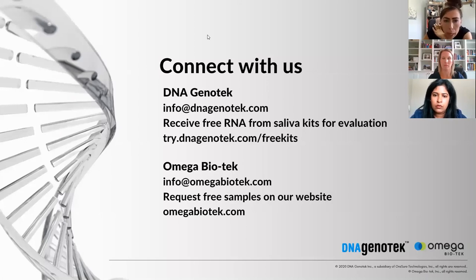Okay. And then another one, if co-infected with the flu virus, would this be interference on the assay? As I mentioned before, the extraction chemistry is robust and it can extract all the viruses that are actually present in the sample. So it can actually be used in multiplex PCR or in respiratory panel testing. So I do not really think that there would be interference from one virus on other virus detection, if that makes sense.